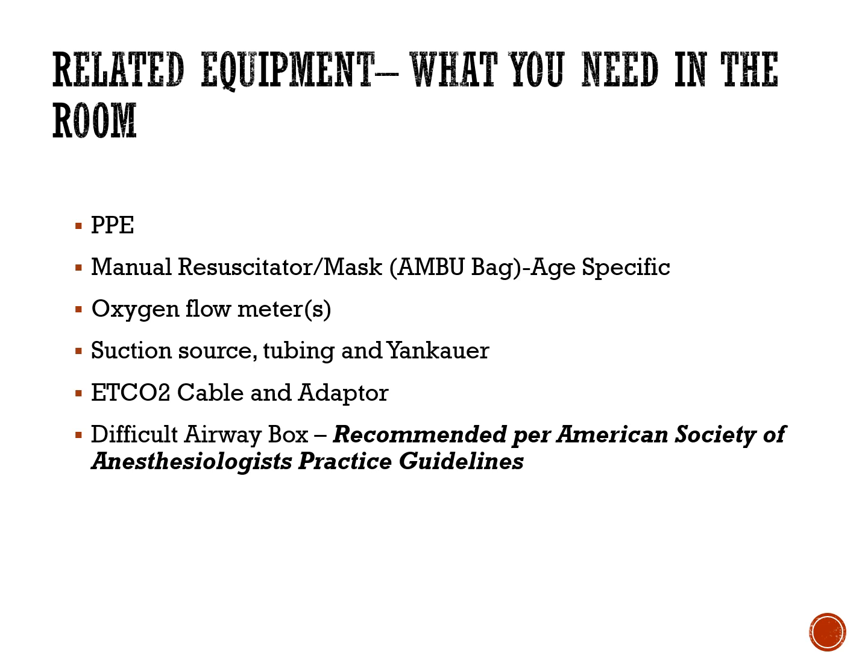Suction source, so tubing and Yankauer, and there's a caveat to the Yankauer. Later in this presentation, I'll be talking a little bit about an alternative to a Yankauer. I don't want to steal my own thunder too much, but more to come on that. End tidal cable and adapter.